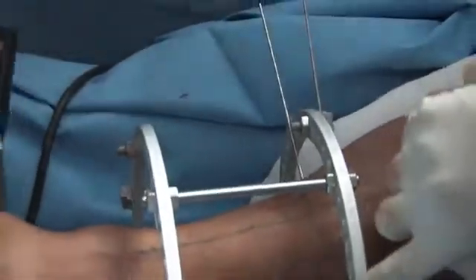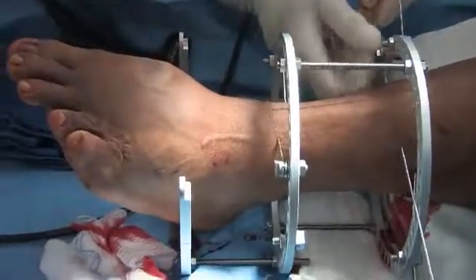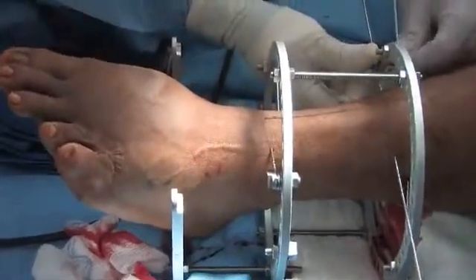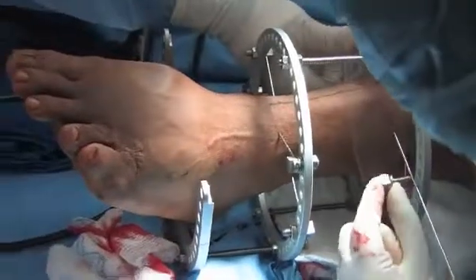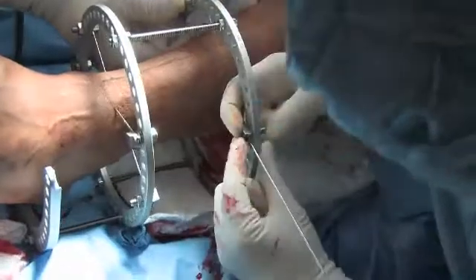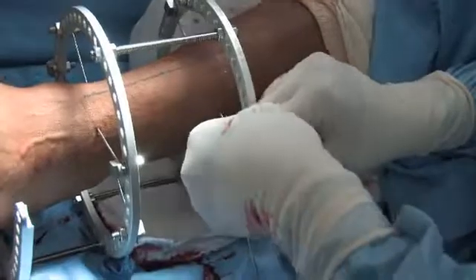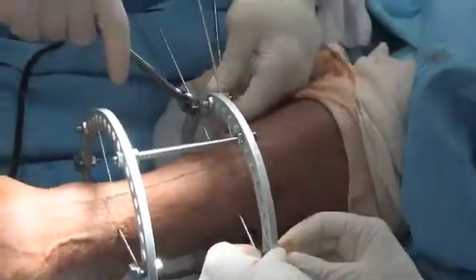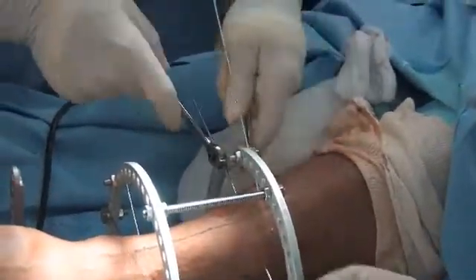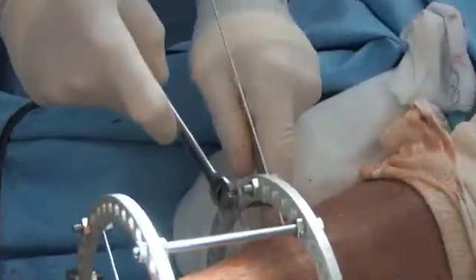So I've got these olives right up against the tibia. We tried to reduce some tension on the skin. The placement looks fine. We don't have to build up too much here. Looks like we're going to try one washer on the lateral side. And again, we'll tighten the olive sides down snug with 2 wrenches. And then we'll tension the other side that has no olive wire. The same tension will be up to 130 kilograms.